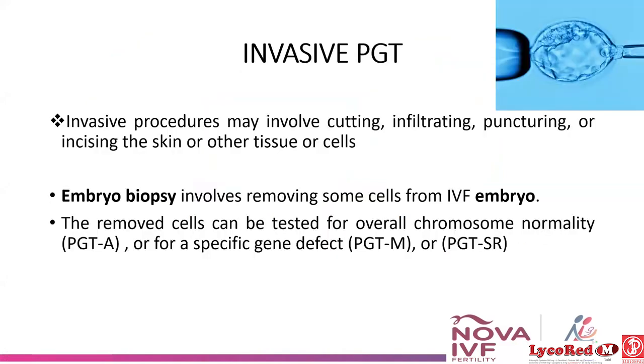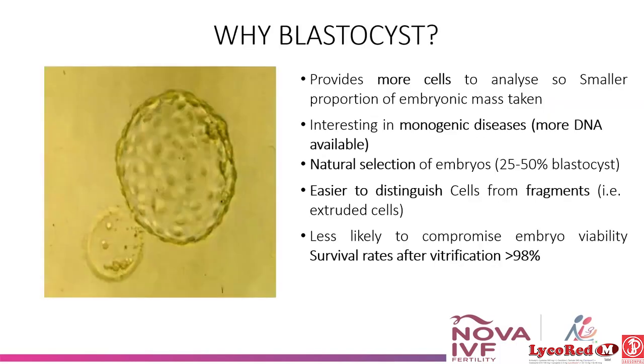So what is invasive? Invasive means there is involvement of cutting, infiltrating, puncturing, or incising the skin or other tissue or cells. Likewise, in embryo biopsy, we give a laser shot, or with the help of a biopsy needle we do the biopsy. It is an invasive procedure. Embryo biopsy involves removing some cells from the IVF embryo, which can be used for PGT-A, PGT-M, or PGT-SR.